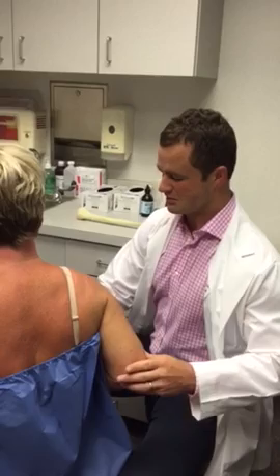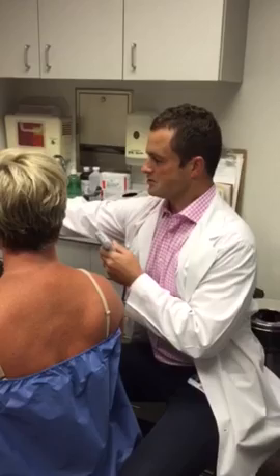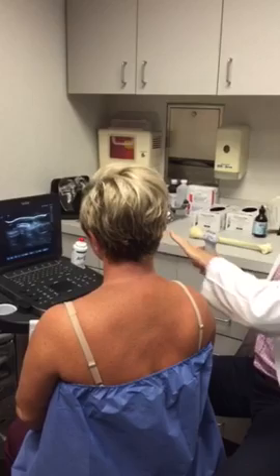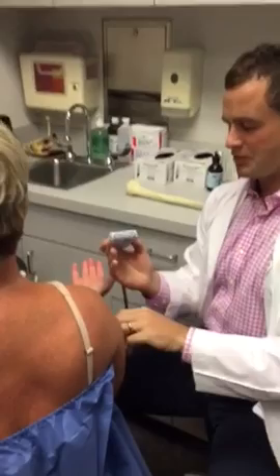You grab your ultrasound probe — most probes have a little nub on one side, and that nub is associated with the dot on the screen. I always like to have the screen match their pathology, so the left side of the screen to me is going to be medial. You can do it whatever way you want; that's just the way my mind associates it.